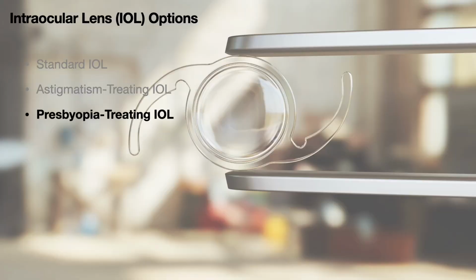Our final category of lenses involve presbyopia-treating lenses, which help get you out of glasses and contacts for both distance and near vision. However, once again, insurance does not cover these lenses. While they are great options for people that are highly motivated to get rid of their glasses, there can be some drawbacks due to the inherent design of these lenses, which include halos around lights at night and some decreased contrast sensitivity. In addition, the eye has to be very healthy to do well with this lens. We can discuss this lens in more detail if you are interested in your appointment and determine if you are an appropriate candidate for it.